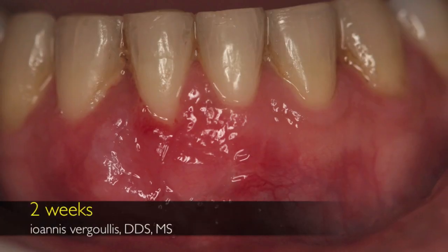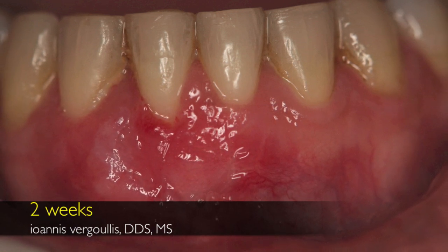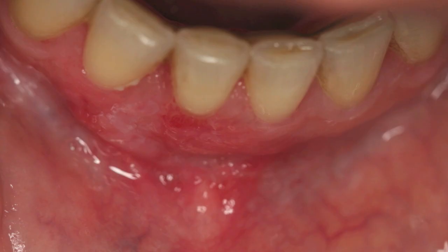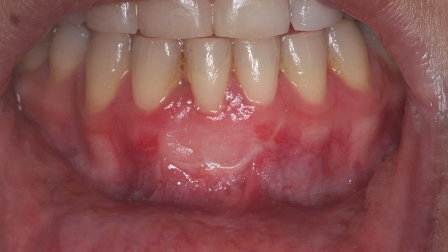This is the healing two weeks later, where we can see that we still have some recession. However, we no longer have the frenum pulling the free gingival margin. Now we need to wait and apply good oral hygiene in the area. Four weeks later we can see that the tissue starts getting more mature.